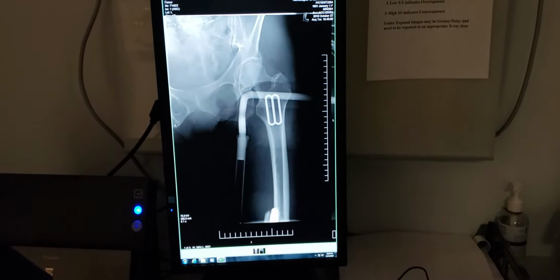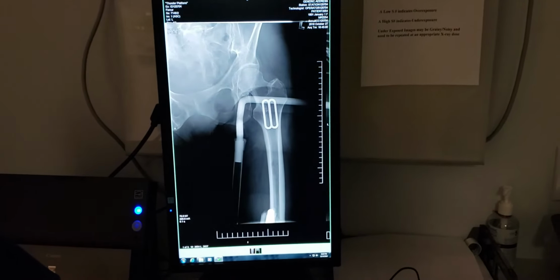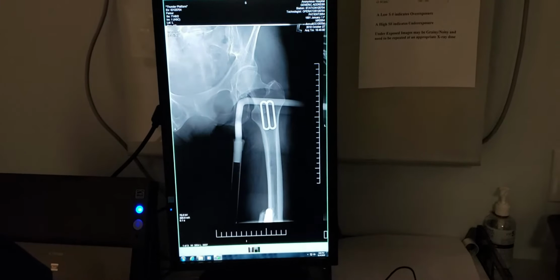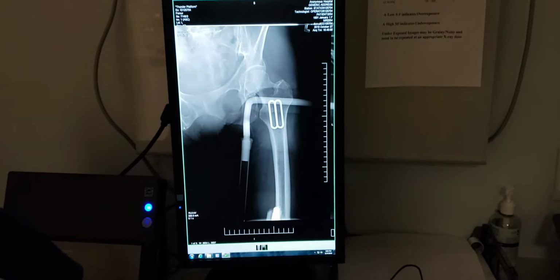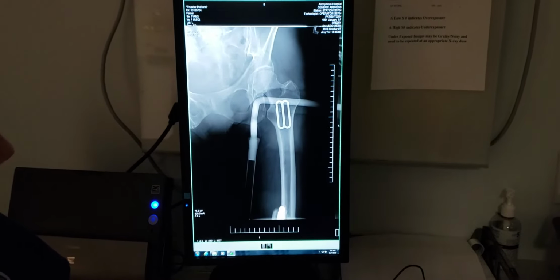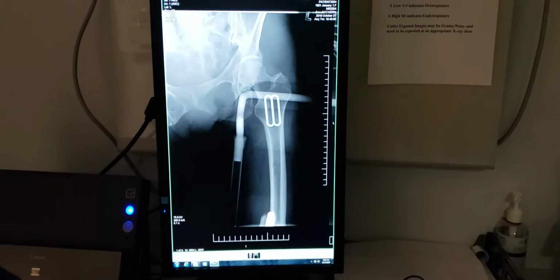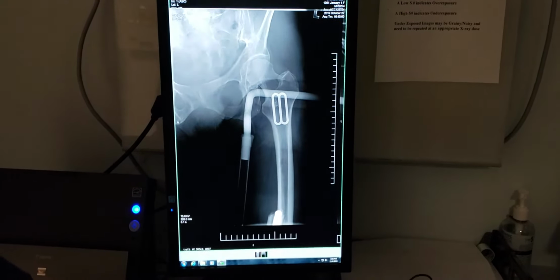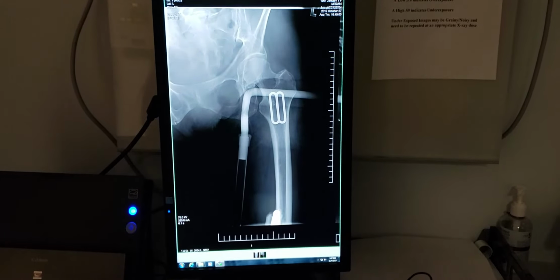Any pathology? Transverse fracture, which is a type of broken bone where the break is at a right angle to the long plane of the bone. And critical thinking was used. The tech used a sliding board to get the patient to the bed to prevent more injury.